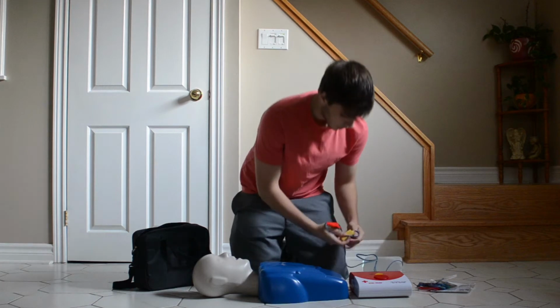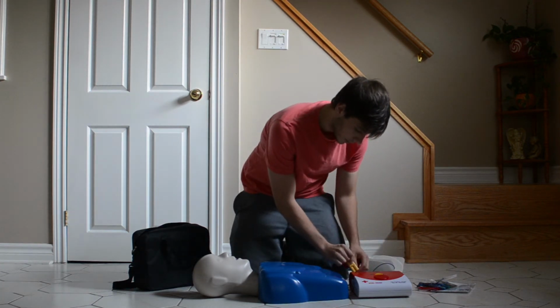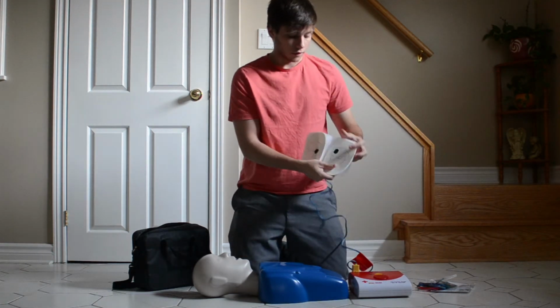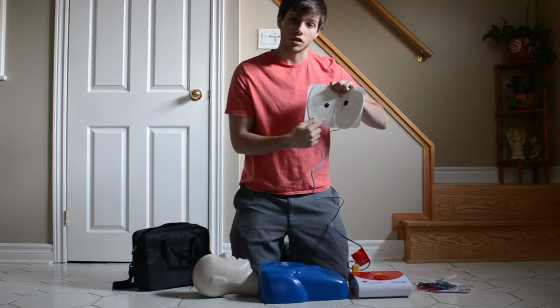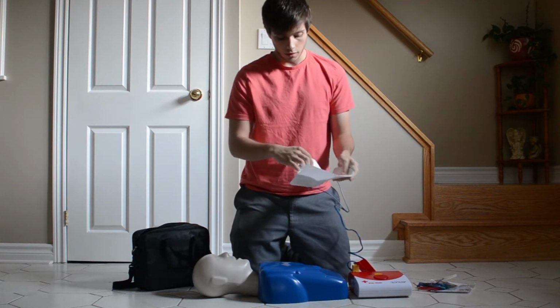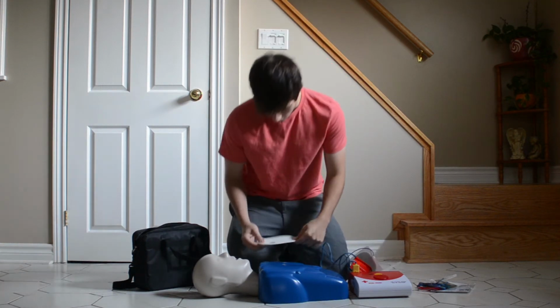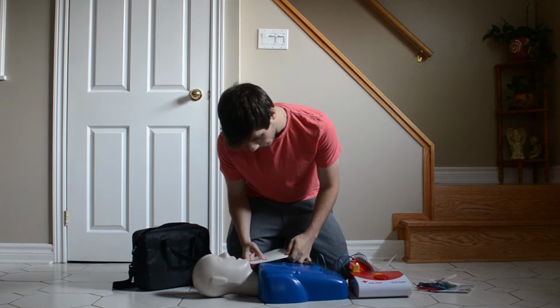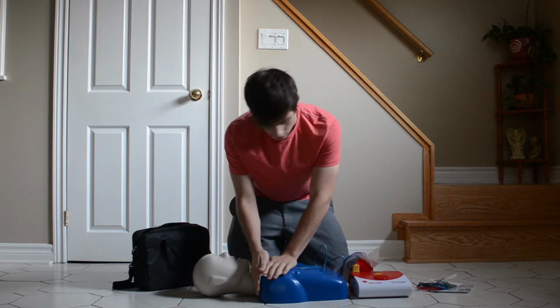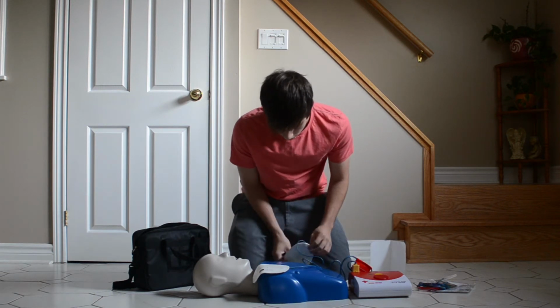Okay, I'm going to make sure I plug in my electrodes, which are the pads that are going to go on the person. Those are in. I want to make sure I follow the instructions indicated on the pads. So the one over the right pectorals, and then one on the left ribs.